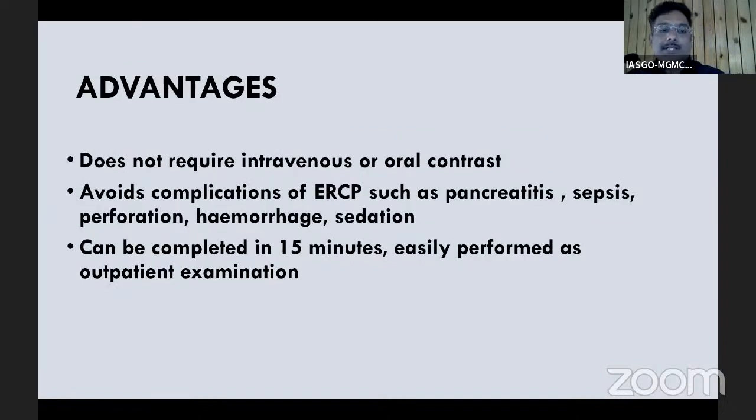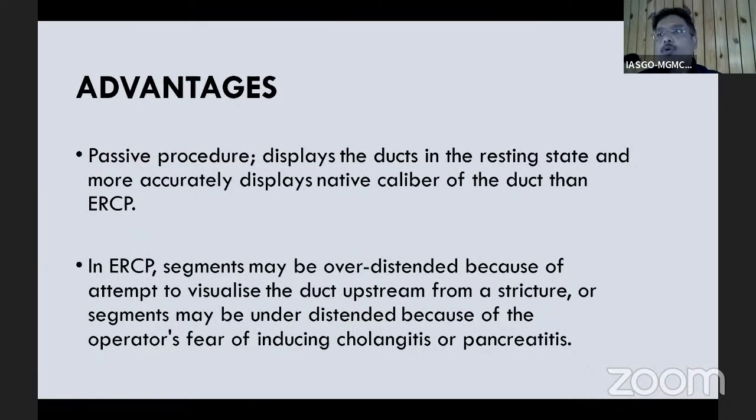Advantages of MRCP are that it doesn't require any intravenous or oral contrast on a routine basis. It avoids complications of ERCP and can be performed on an OPD basis. It's a passive procedure, so it displays the ducts in their resting state.